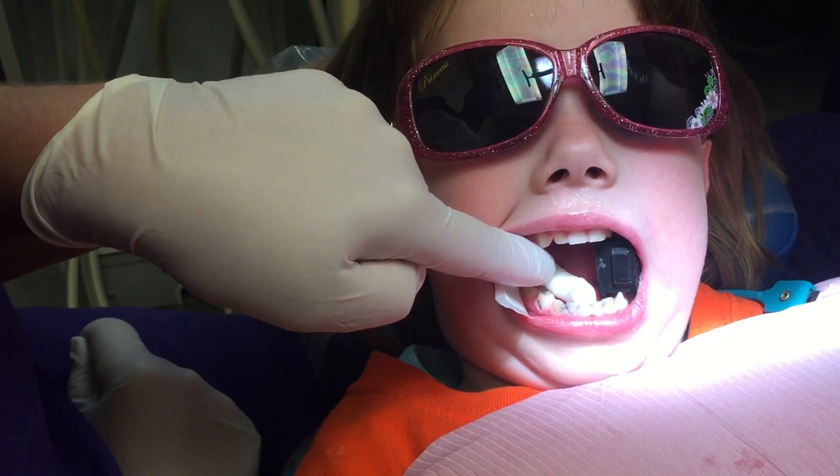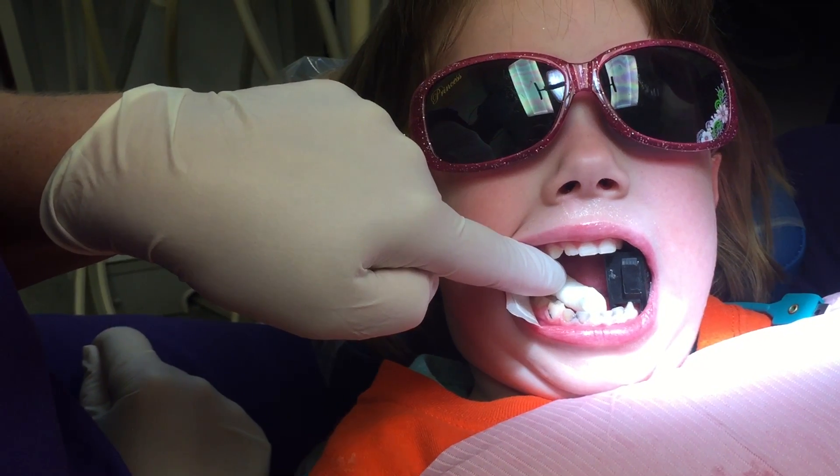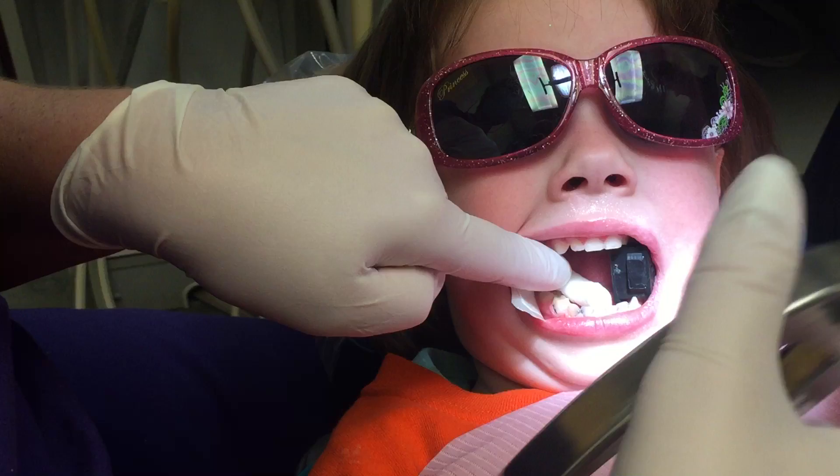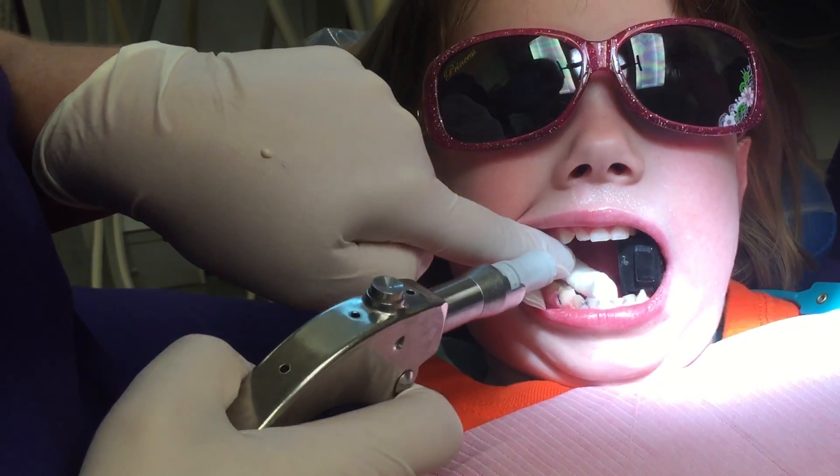I'm gonna squirt a little bit of paste on here too — she's getting it all ready. It looks like frosting. We're gonna put frosting on your tooth, sugar-free!